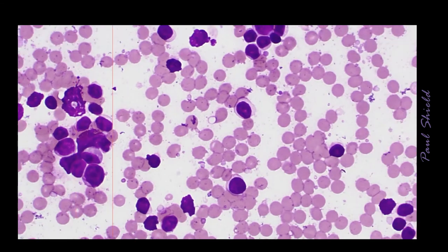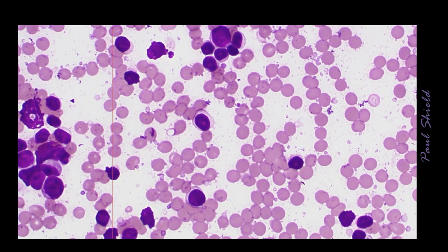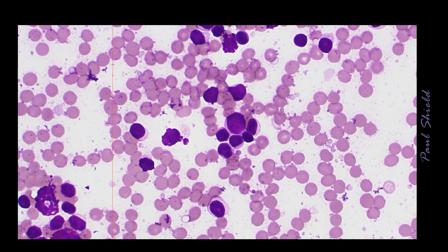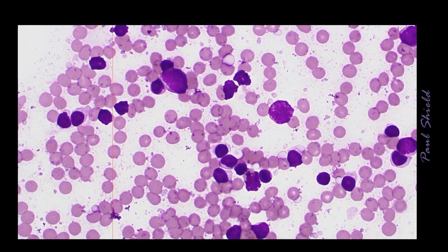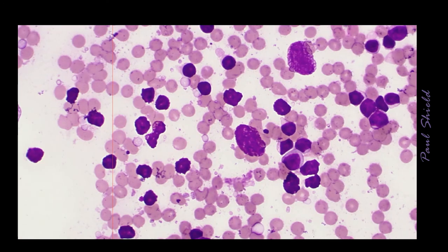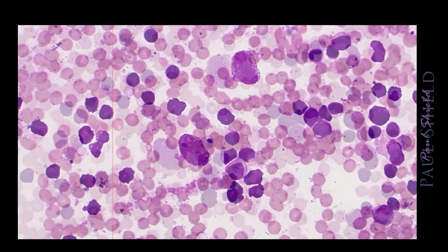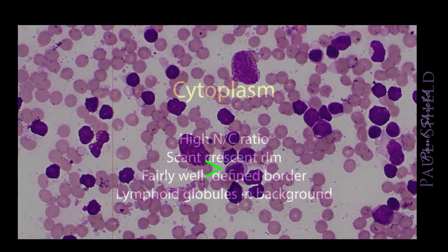That can be problematic in distinguishing this from a neuroendocrine carcinoma, but it should be just focal, and so it's really just a sort of preparation artifact, and it certainly shouldn't be all over the slide. You can see here most of the cells are individual, and especially where they've got cytoplasm, they're lying out pretty much on their own and not growing together.